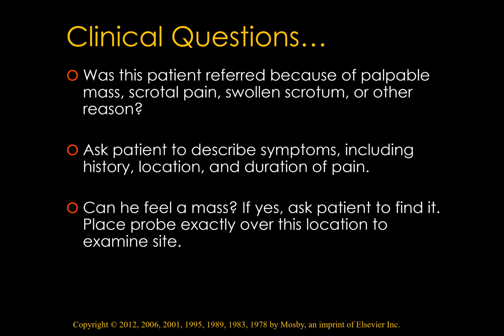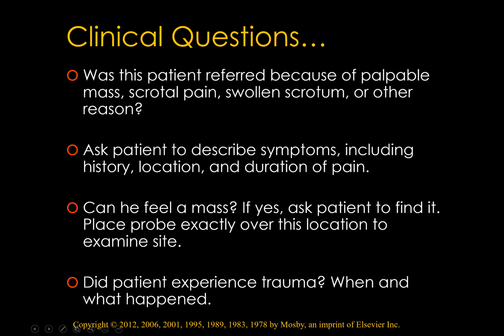Again, ask the patient if he had a trauma. Ask him when and what happened. This information is necessary not only for guiding the examination, but also for interpretation. Scanning techniques.